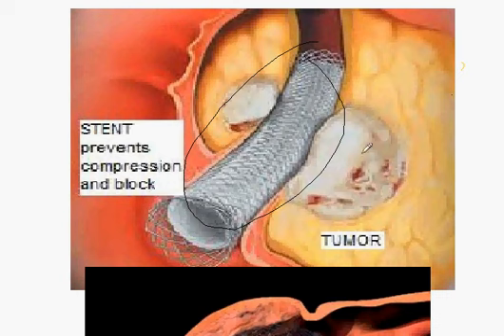The second thing is that the growing tumor may obstruct this stent. It may push from this side and push from this side and obstruct it, or a bolus of food may come and obstruct this stent, and in this case you will need an endoscopy to remove that bolus of food, or to deal with the tumor obstruction or growth that obstructed the stent.